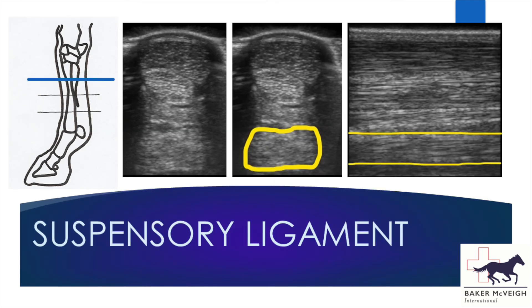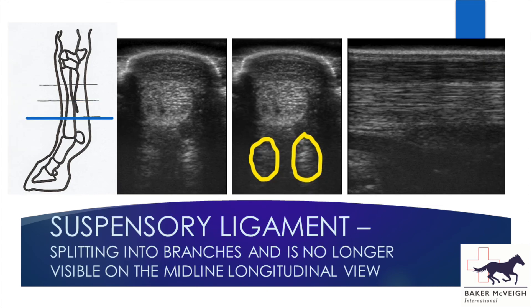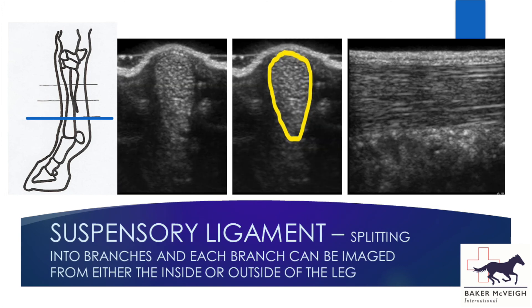The suspensory ligament has fairly indistinct margins high up the leg as it fills the space between the splint bones, and the proximal suspensory is also attached tightly to the cannon bone at its origin. As we come down the leg the ligament can be seen as more of a distinct round structure. As it splits, it can no longer be seen clearly from the back of the leg, so we change our probe position and come round to the side of the leg to more clearly image the suspensory branches.